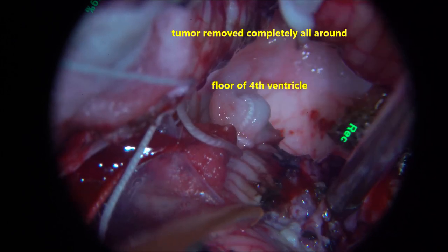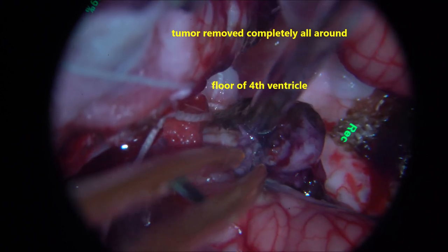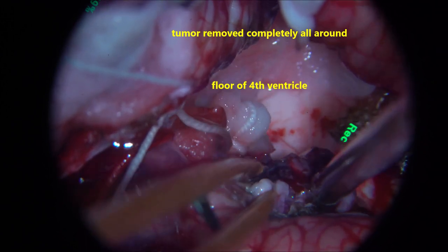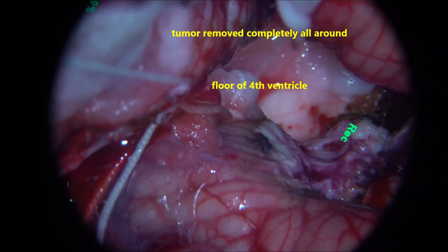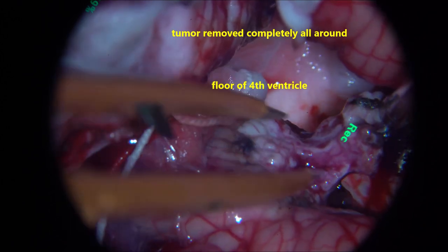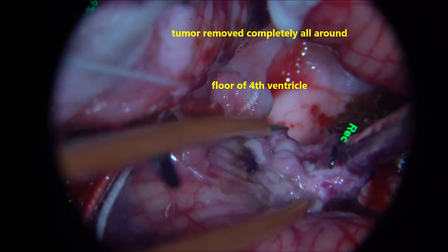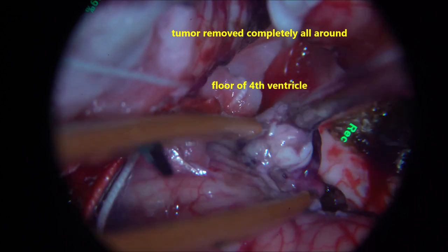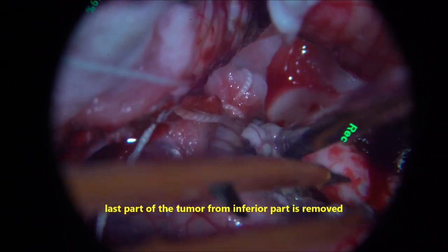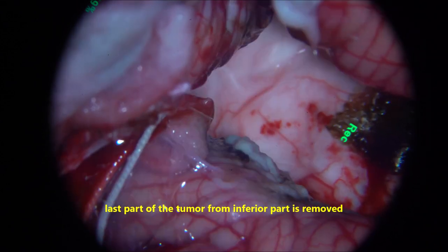There is a small bit of tumour remaining in the lower lateral part on the right side of the cerebellum, in the inferior cerebellar peduncular region. That part is again coagulated and excised. Some amount of cerebellar tissue is also involved there, and it is gently sucked with dissection after coagulation and excised completely.